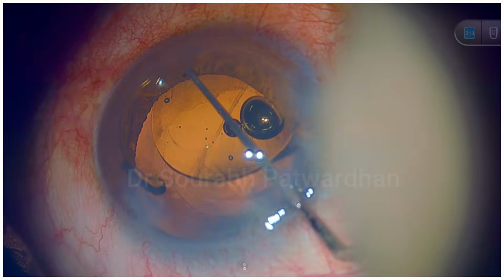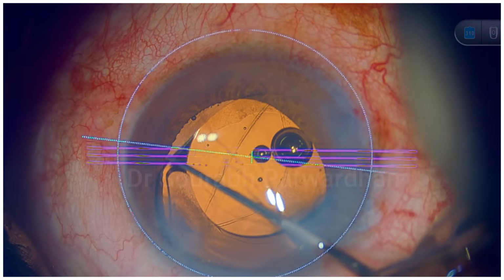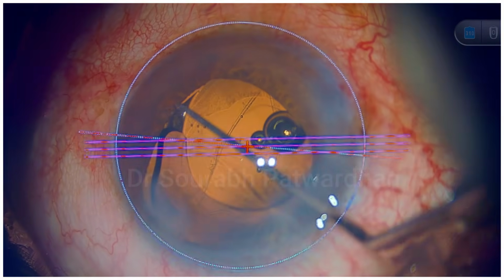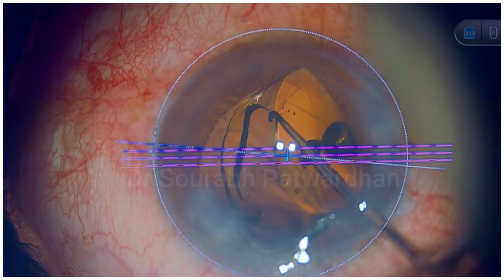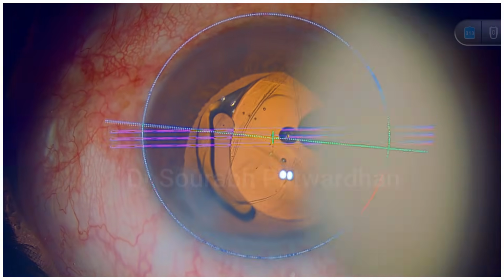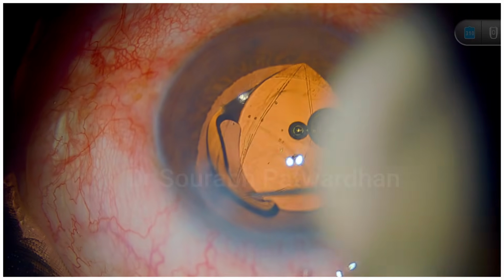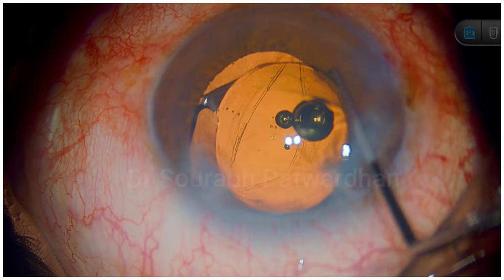I didn't try to put it directly into the bag because it might just drop down through the ruptured posterior capsule. Now because it's a toric IOL, I just placed it in the anterior chamber with the same alignment which I want in the bag, and very carefully using a Sinskey hook, I have pushed the haptic into the bag there.